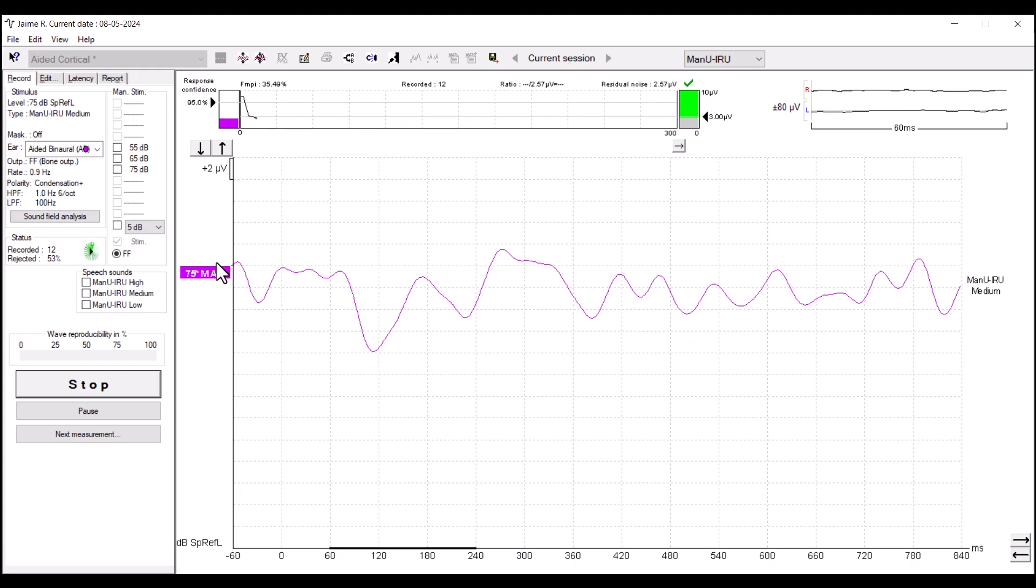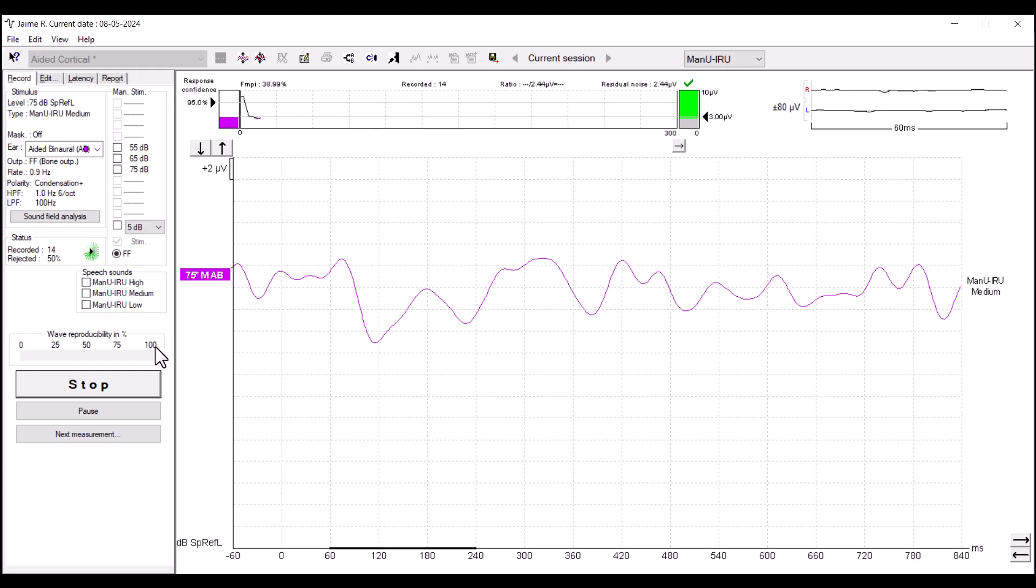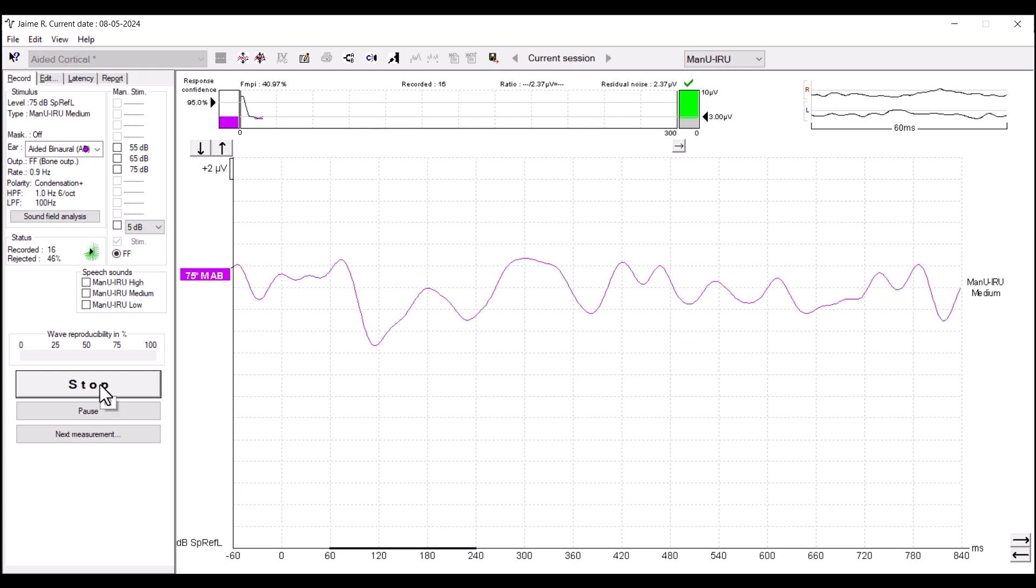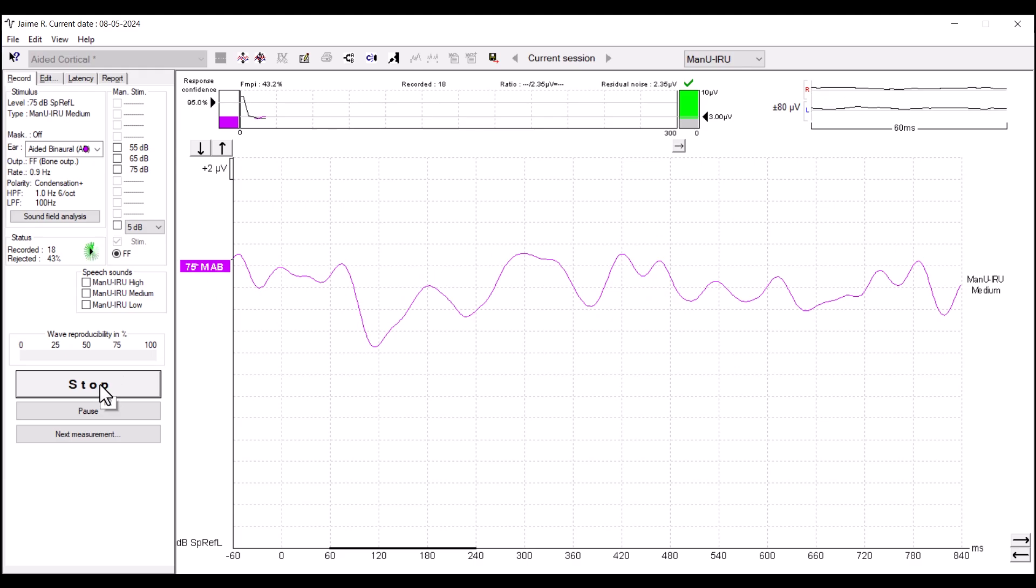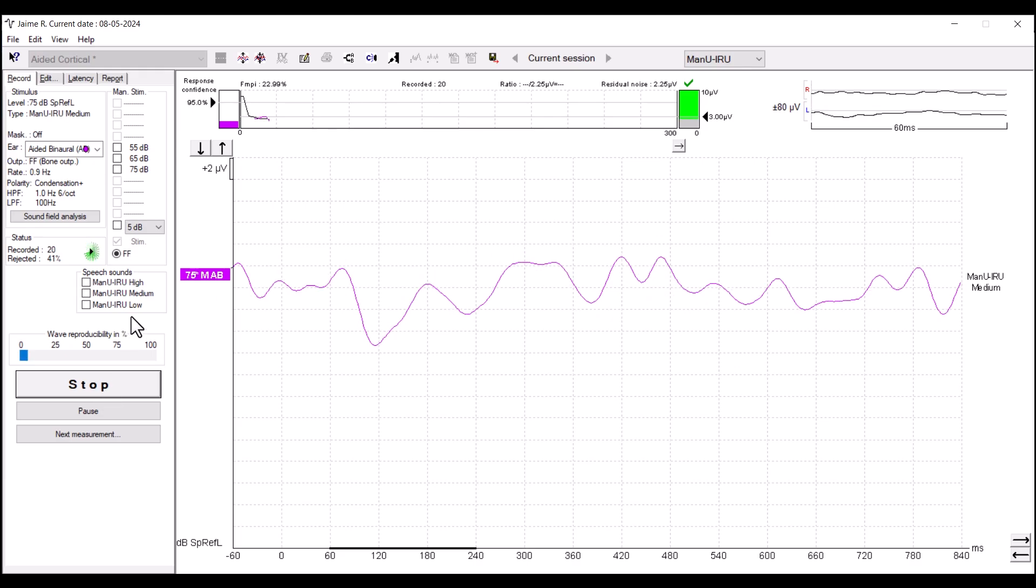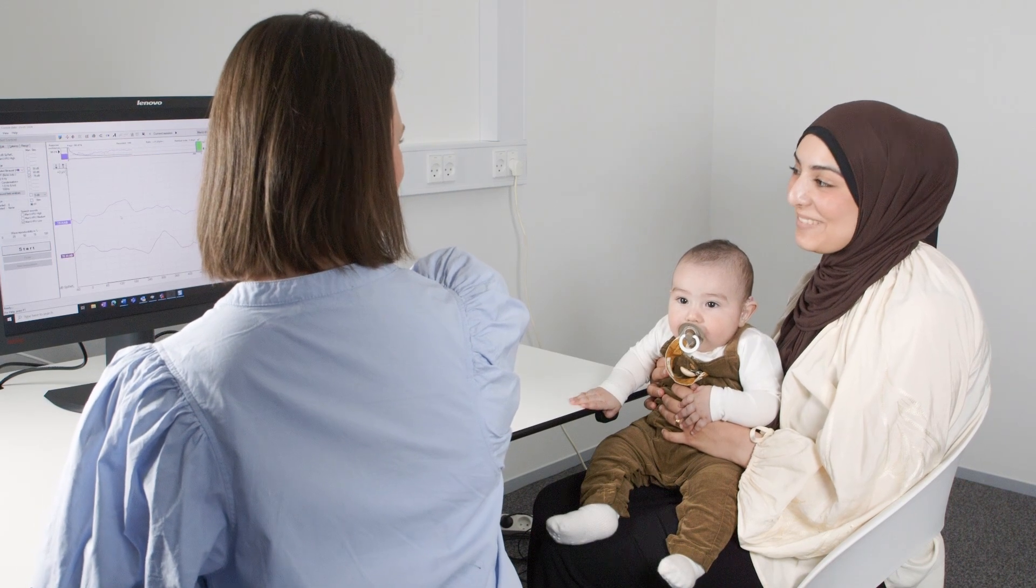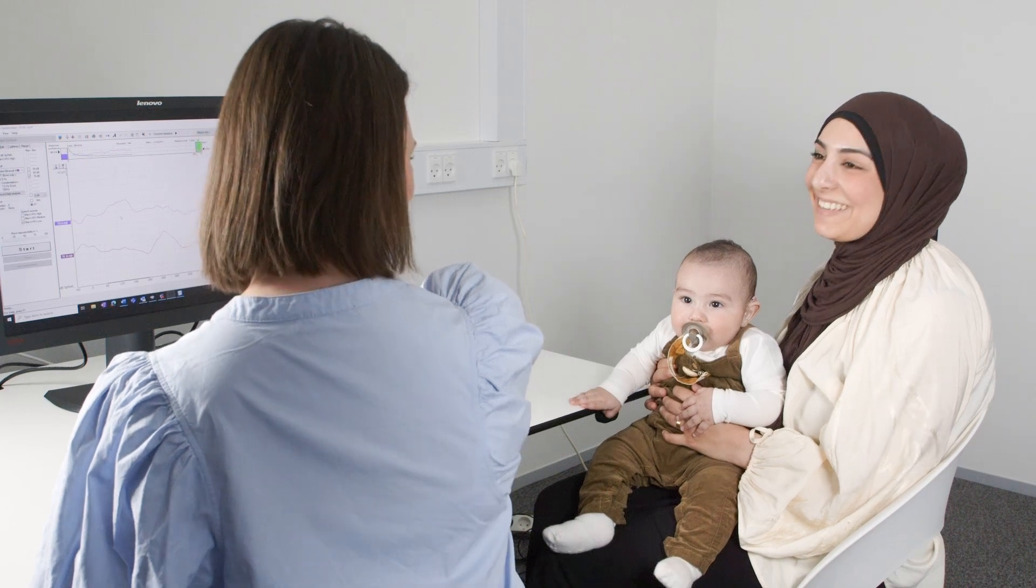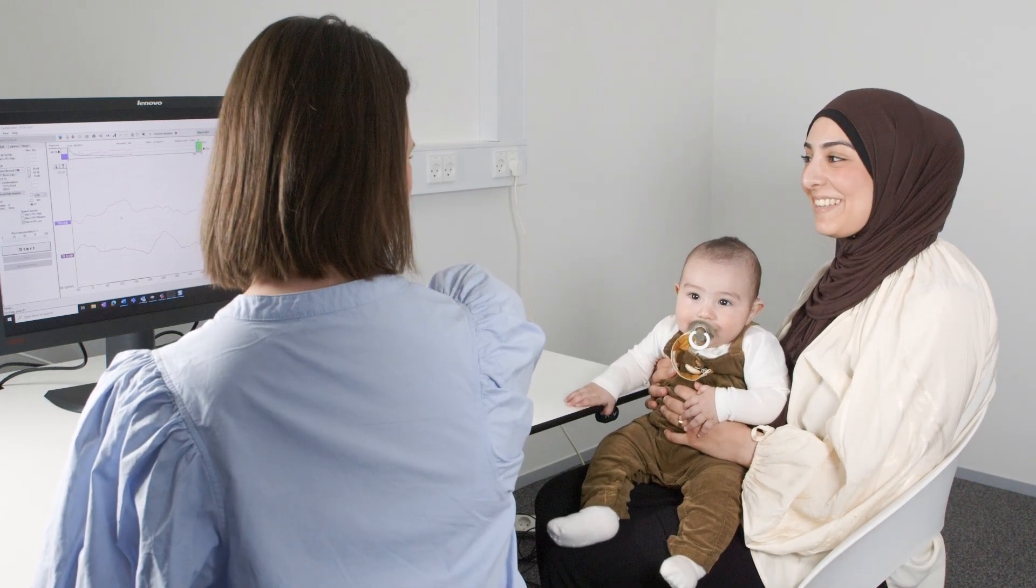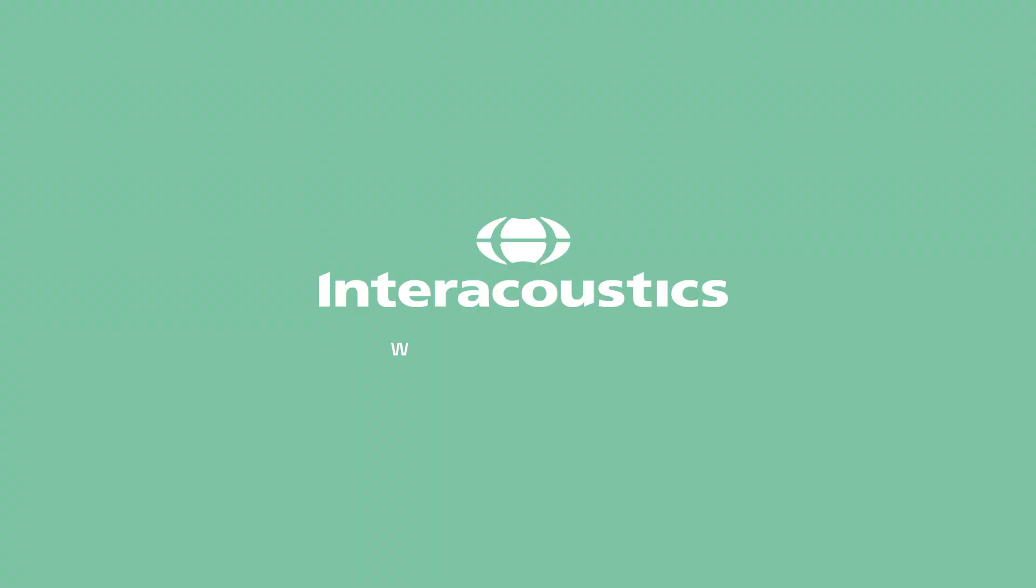Depending on the results obtained, you can move on to testing another frequency, intensity level, or a different condition. Use the results of the test to confirm whether the patient is getting the intended benefit of their hearing instrument or whether adjustments are needed to improve their access to speech sounds.